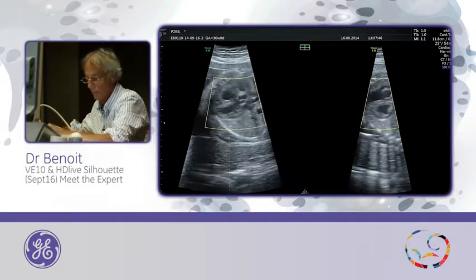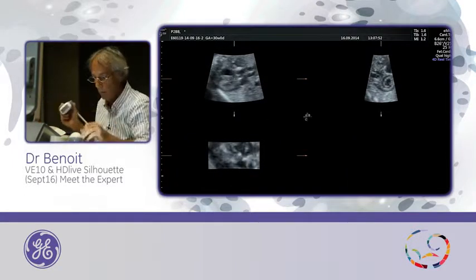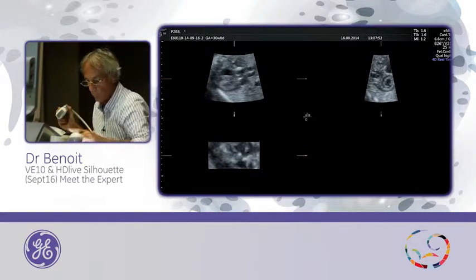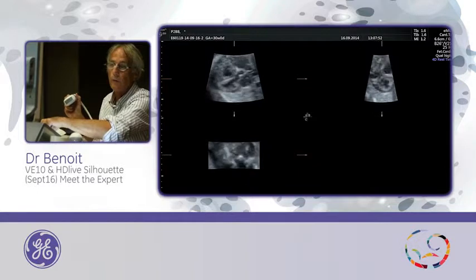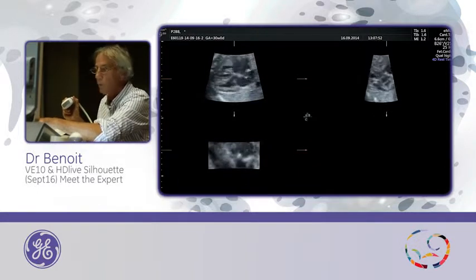I will do it again, here, without movement. Start. Freeze. It's okay. And now within the heart, I will move. Start. And this is not a STIC, this is a 4D.